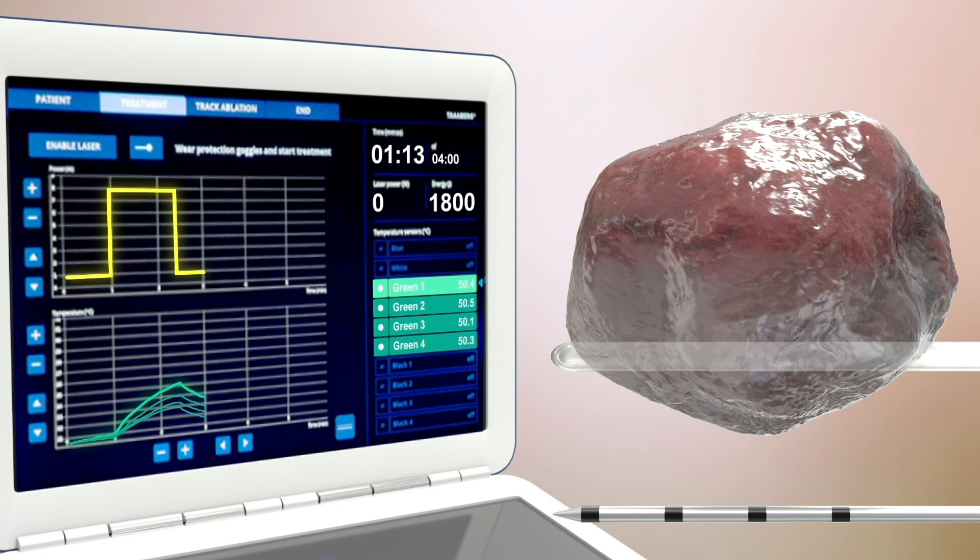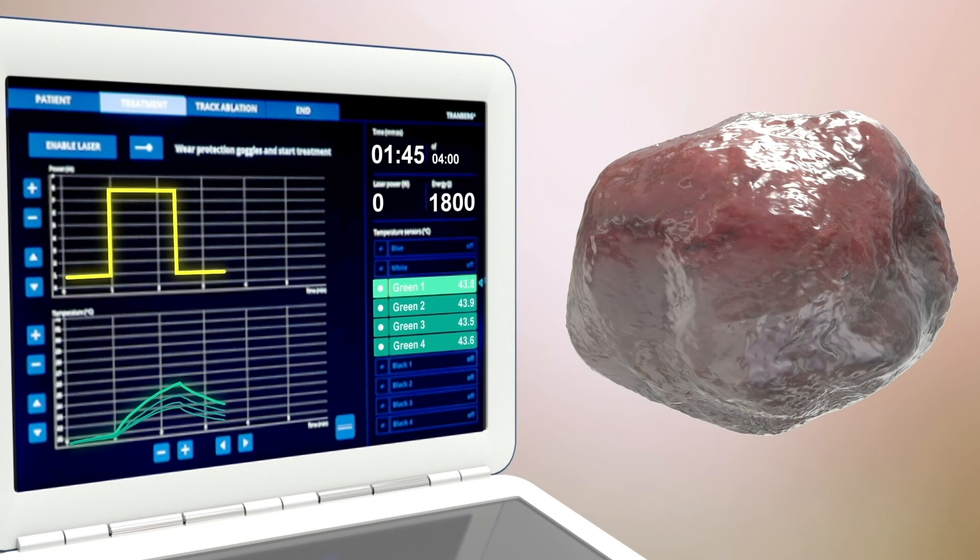Upon completion of this individual treatment, the temperature probe and catheter with laser applicator are removed, and the process is repeated until all areas called for in the treatment plan are ablated.